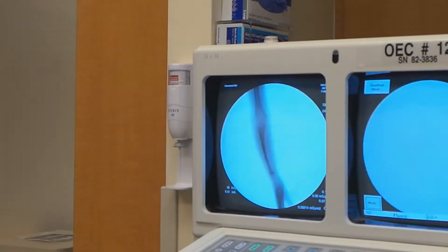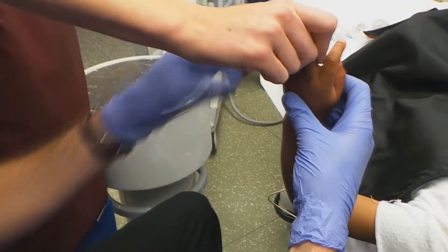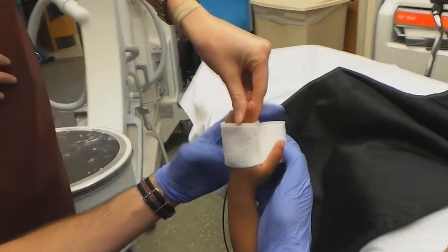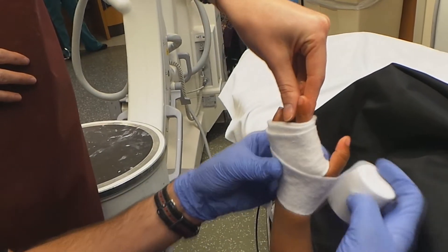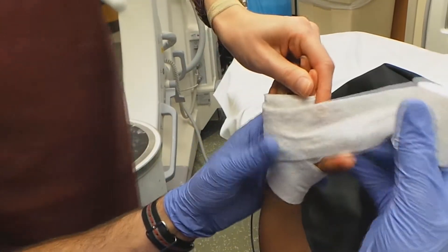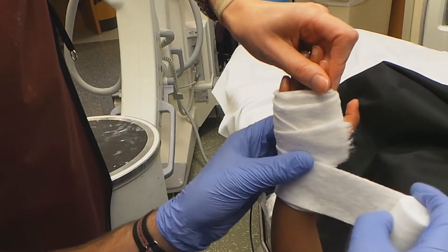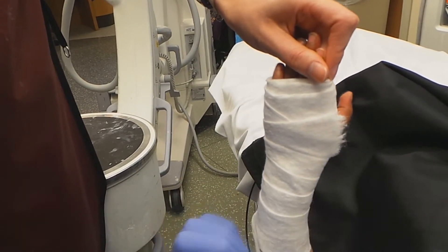So that's a fairly simple reduction. We'll just get her splinted right there. Hold right on the fingertips. How about the other hand? Could be a little easier. Yeah, perfect. A couple very simple splinting tips: avoid any wrinkles or dimples in the web roll as much as possible. This splint should extend all the way out to her MCPs. Make sure there's plenty of padding there. If you use a smaller width web roll, it's easier to lay down and go around corners on little kids and tight spaces.